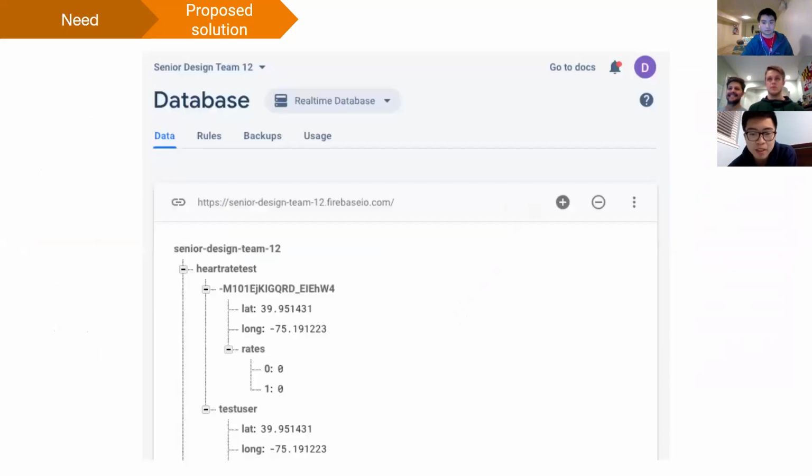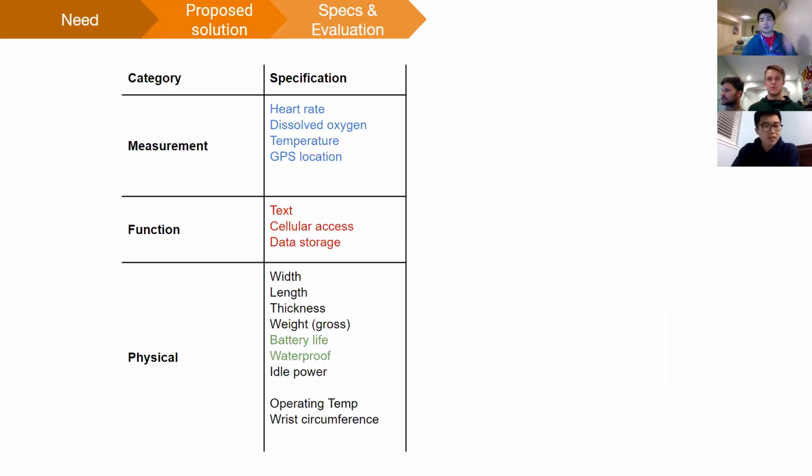Next slide. To store the user data, we spent this past semester hooking our software up to a robust backend offered by Google Firebase. We chose this backend because it provides a real-time database with live changes every time new information is being inputted. Additionally, they provide encrypted key data by default, allowing our product to be compliant to several data security codes. Next slide.